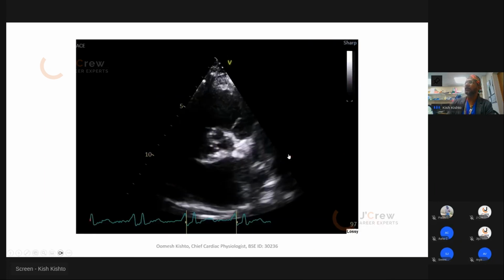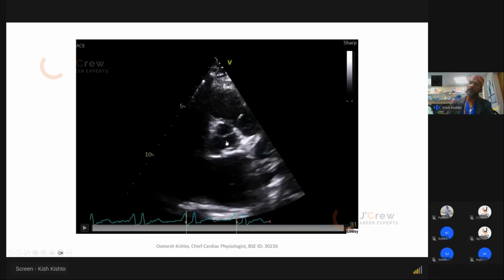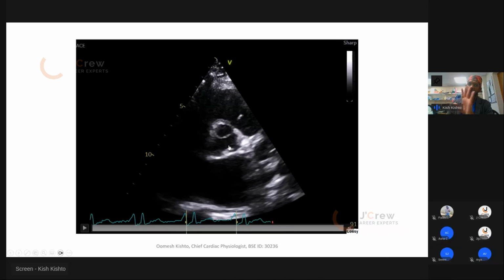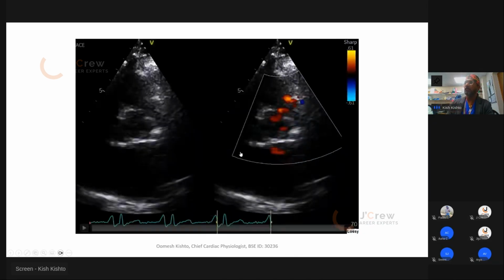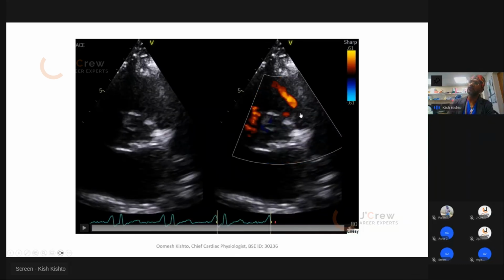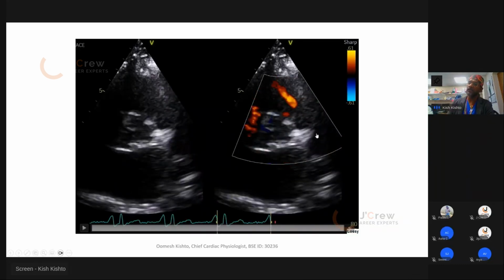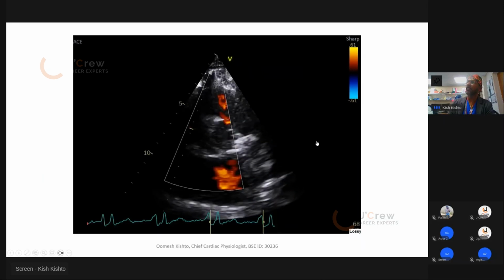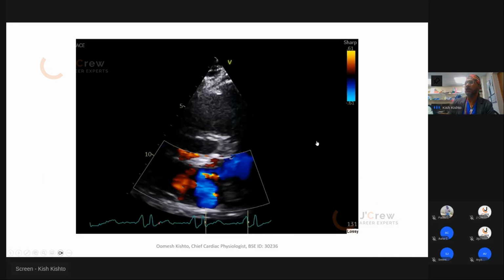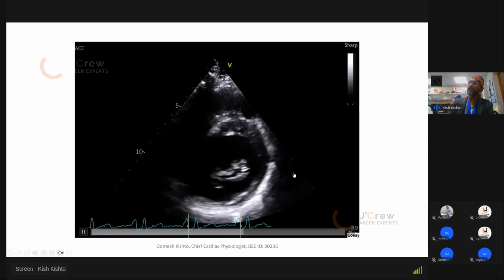Let's not focus on that. Then in the short axis view, you can see the tricuspid is mildly sclerotic, but all three leaflets are opening well. We saw there are two focal jets coming from the PR, mild. Just going to skip all that, guys. There's no communication across the atrial septum, and this is my short axis view.